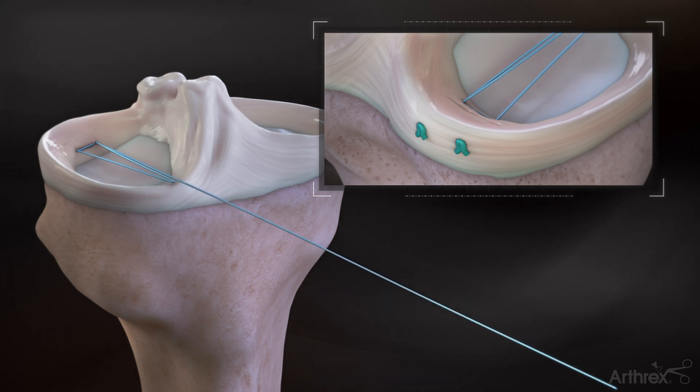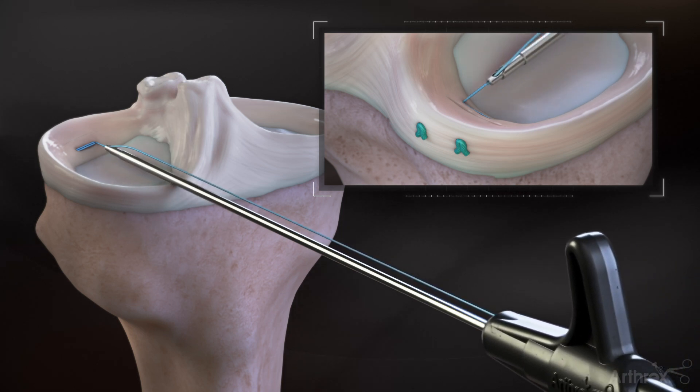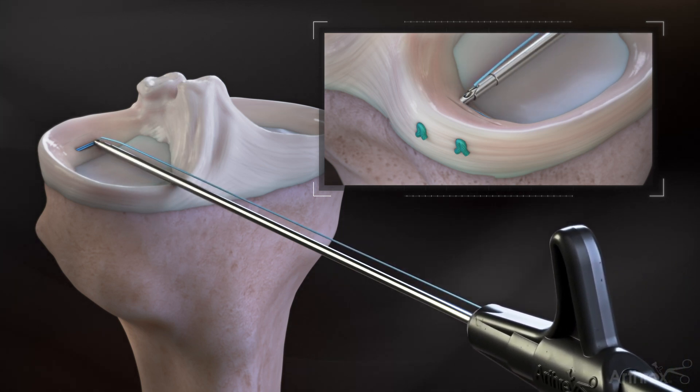Tighten the repair construct by pulling the single suture to reduce the tissue. Introduce a suture cutter to cut the suture at the tissue.